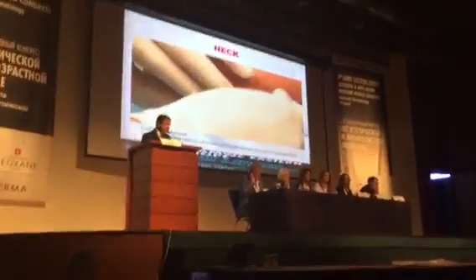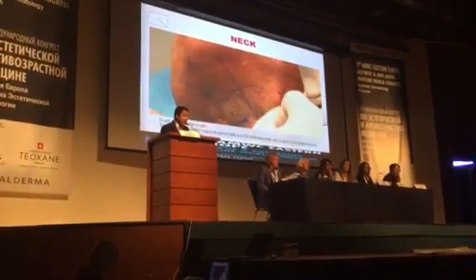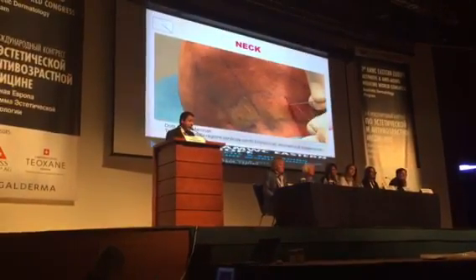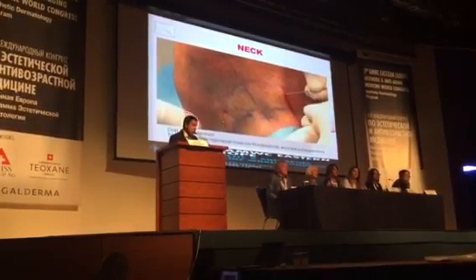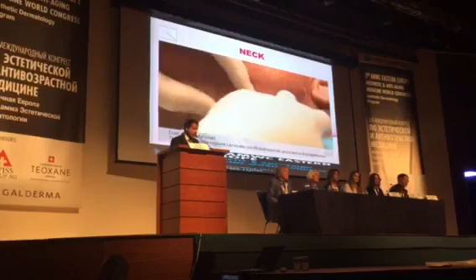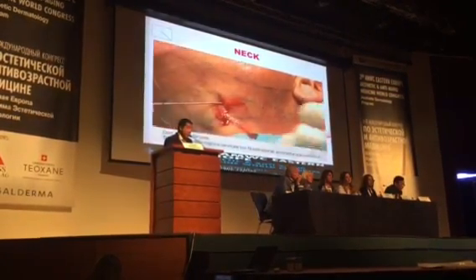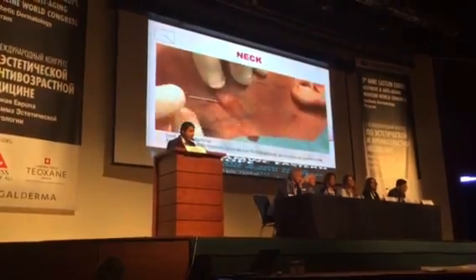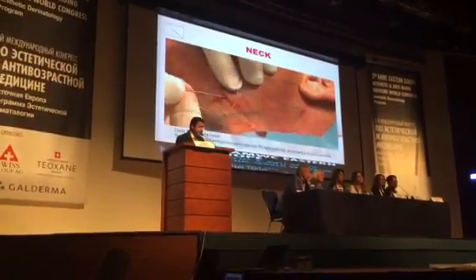Sometimes when I have a very small patient with a small neck, it's possible to go in above the ear and to exit in the medial region and then to exit in the other lobe. But usually I exit twice in this procedure. Then I make another rotation of 180 degrees. I go forward and I exit above the other ear.